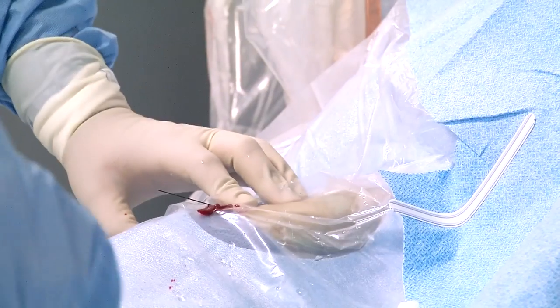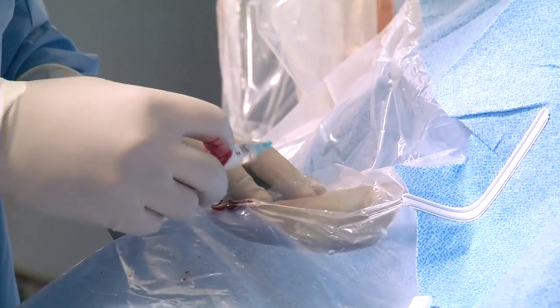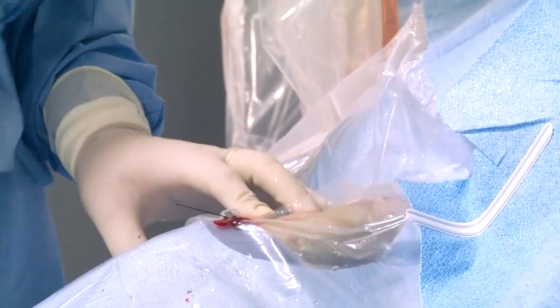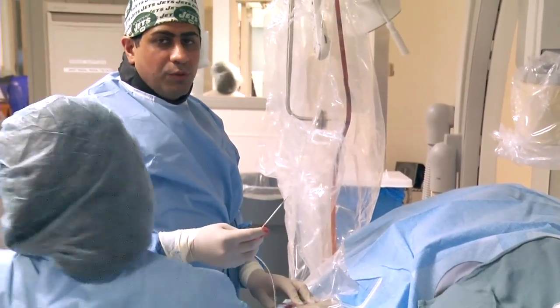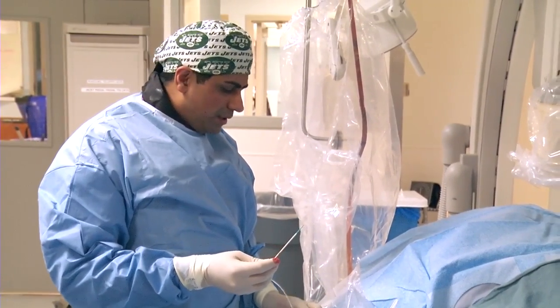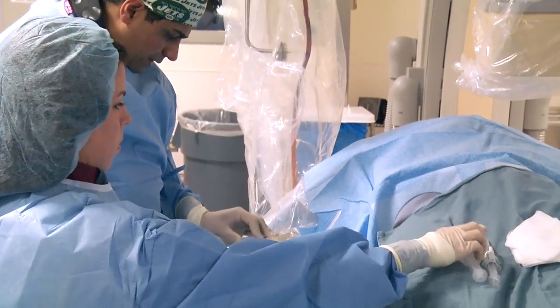And now at this point, we can give a little bit more lidocaine, so the patient doesn't have discomfort when we advance the sheath. Now we're going to use a 5 French sheath to perform the diagnostic angiogram. Multiple studies have shown that sheath size does correlate with radial artery occlusion. So you want to use the smallest sheath you possibly can.